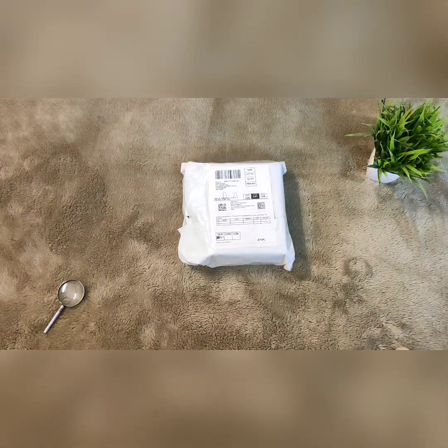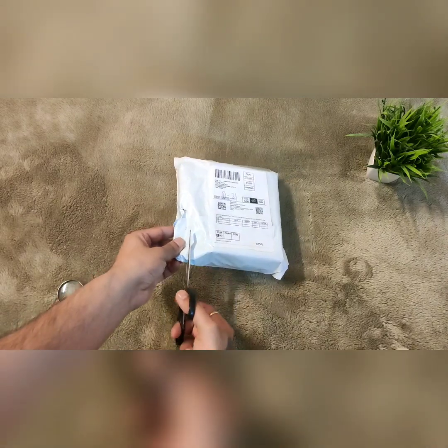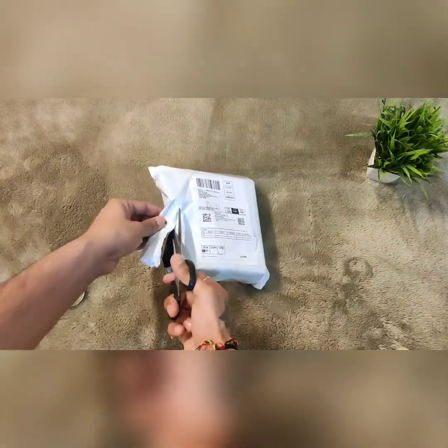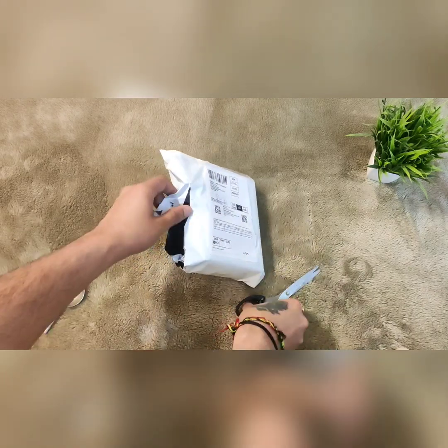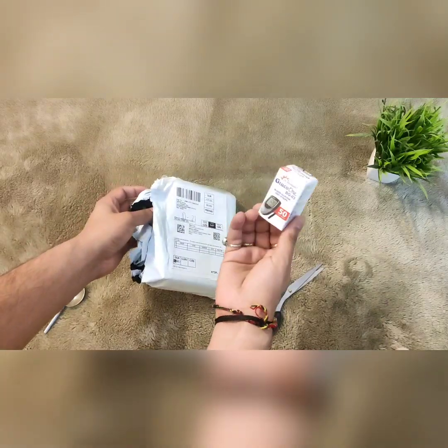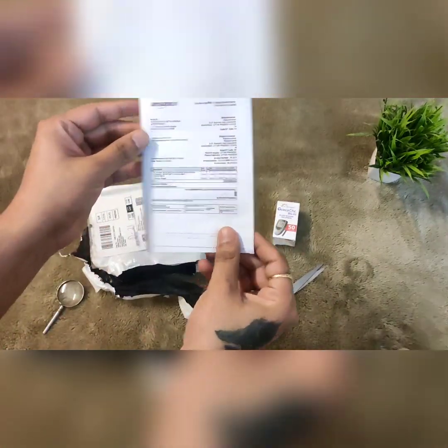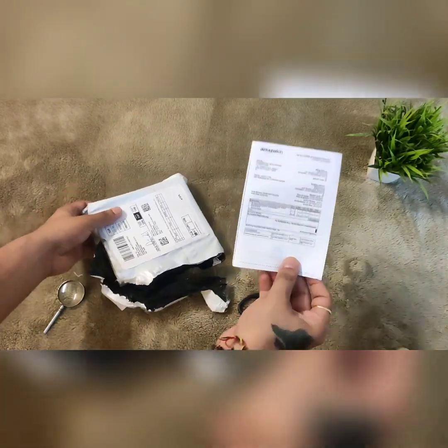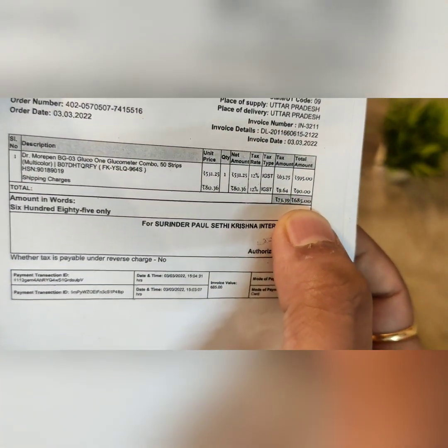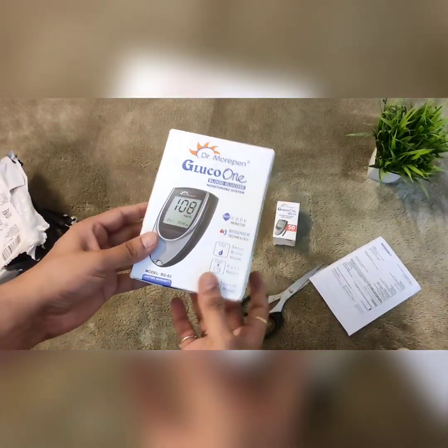Which can measure the amount of sugar in your blood. Let's begin to unbox this gluco meter. Here comes the 50 free strips which we have received along with this gluco meter. The price comes out to be only 685 rupees.